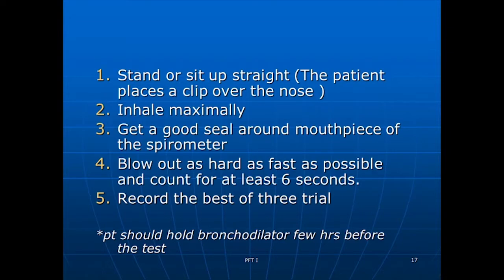And if the patient's on a bronchodilator, they should hold the bronchodilator. It says for a few hours, but it should be for 8 hours before the test. So anybody who's on a bronchodilator, they need to assess the actual values without the bronchodilator therapy. So they usually will hold that for about 8 hours.